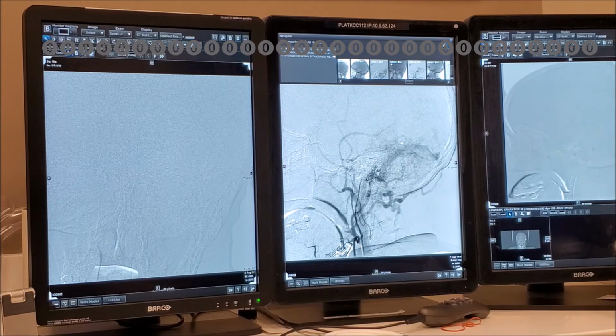Okay. But we have a similar situation as in the other side, right? See where your catheter is primarily, looking into the ascending pharyngeal, right? Oh, what is this one? There's a blood supply to the 11th cranial nerve. Okay, and it may anastomose with a vert. C4 we call it. Seldom is so prominent. But it's very typical, comes from the ascending pharyngeal here.